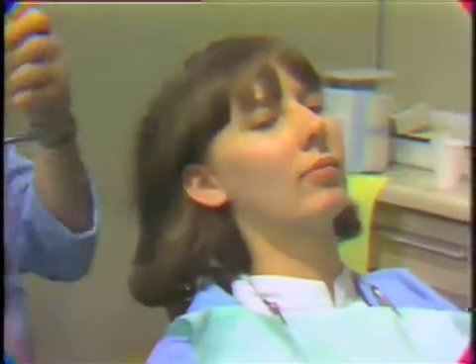The only other thing that we would need to transfer the cast to the articulator would be a centric registration that we can use to mount the mandibular cast in relationship to the maxillary cast. Now, the only position where these two casts would agree without the teeth in contact would be along the terminal hinge movement.